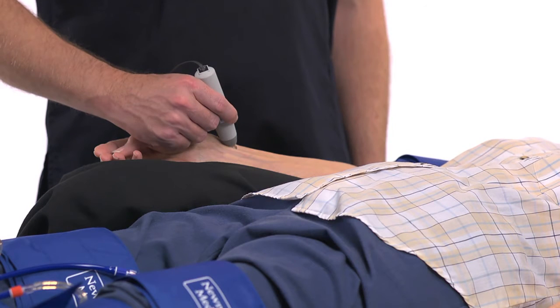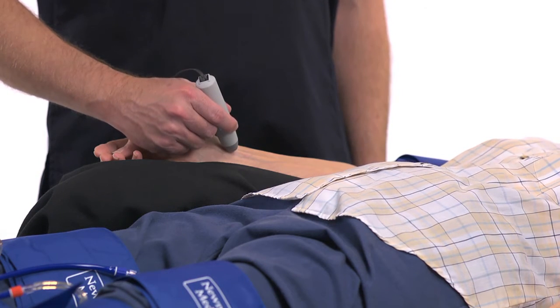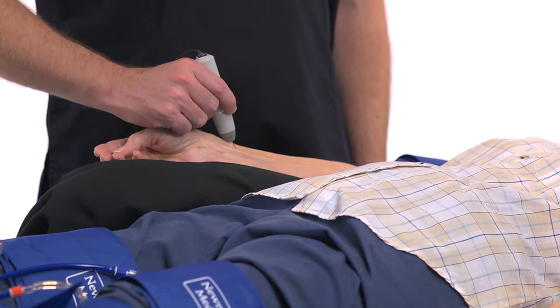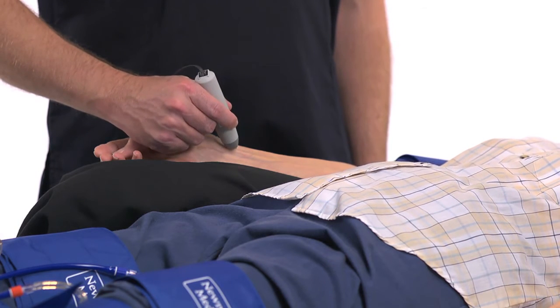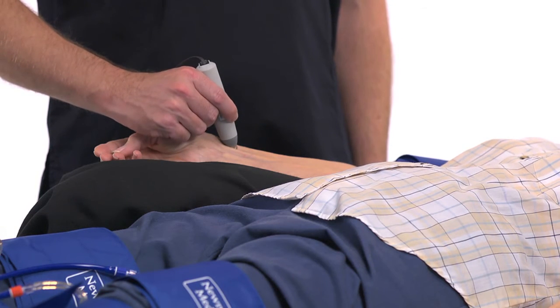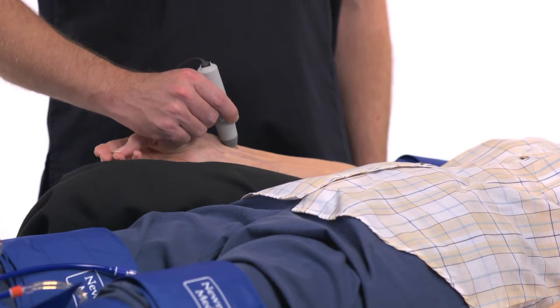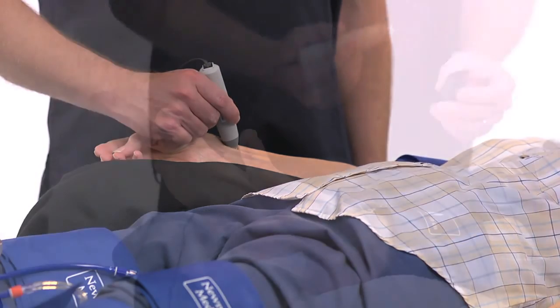Point the probe proximally along the length of the artery. Press lightly so that you don't press on the artery so much that you occlude the flow with the probe tip. Slowly move the probe across the artery until you hear the loudest sounds. A key when taking pressures is to be able to keep the probe in place as the cuff is inflated and deflated, even when the sound disappears when the artery is occluded by the cuff.